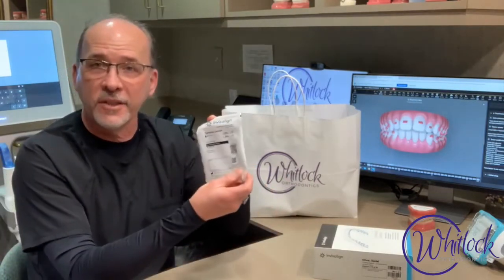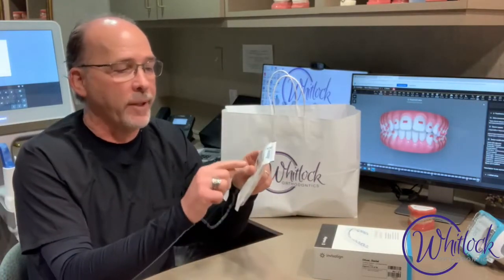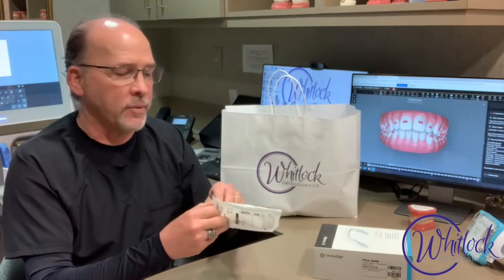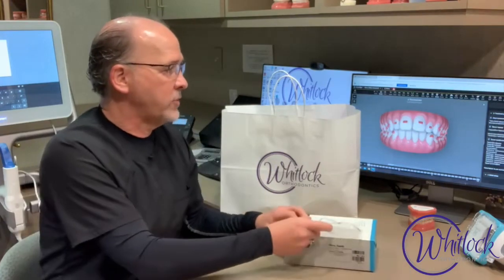Then you have each individual bag. When you go, make sure that you're reading the number, that you're going from stage to stage — from one to two, two to three. It's really important. A lot of time, technology, and experience has gone into designing each one of these just for you on your journey to get your smile. So it's really important that you wear those as directed.